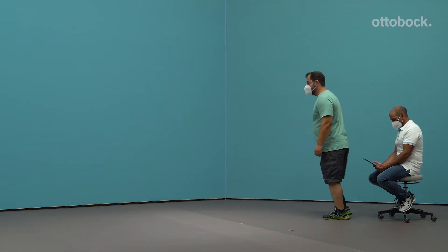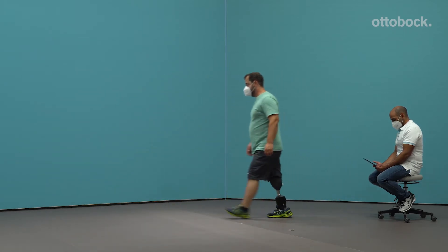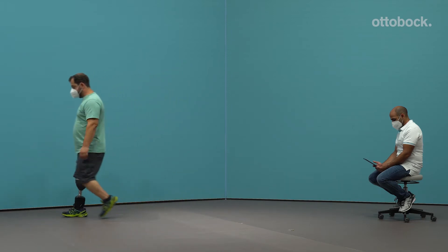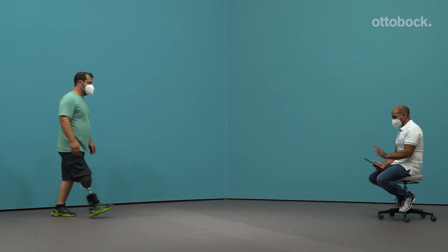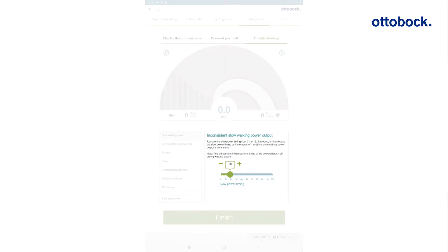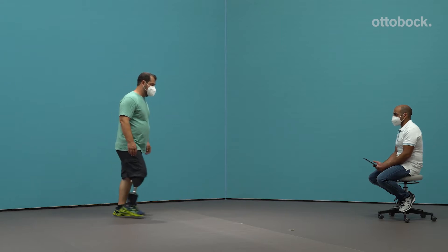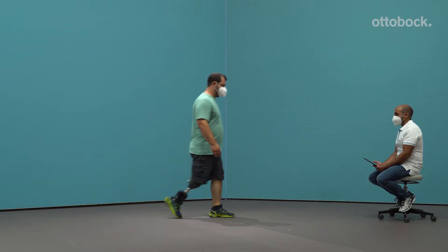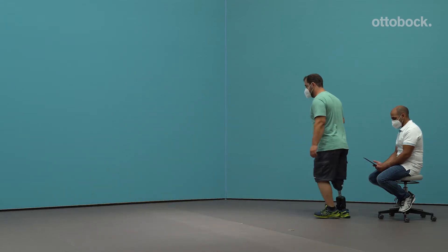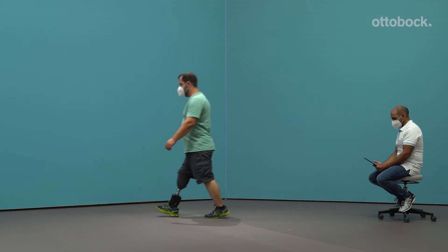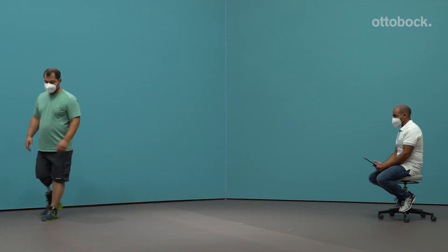The user reports the power output is inconsistent when walking slowly. Reduce the slow power timing setting from 21 to 18. If needed, further reduce the slow power timing setting by increments of 1 until the slow walking power output is consistent. This setting influences the timing of the powered push-off while walking slowly.